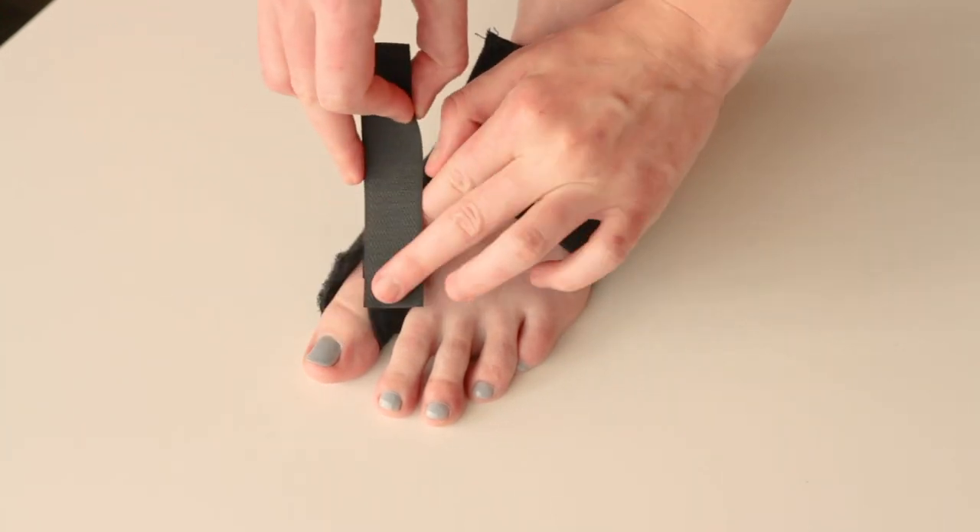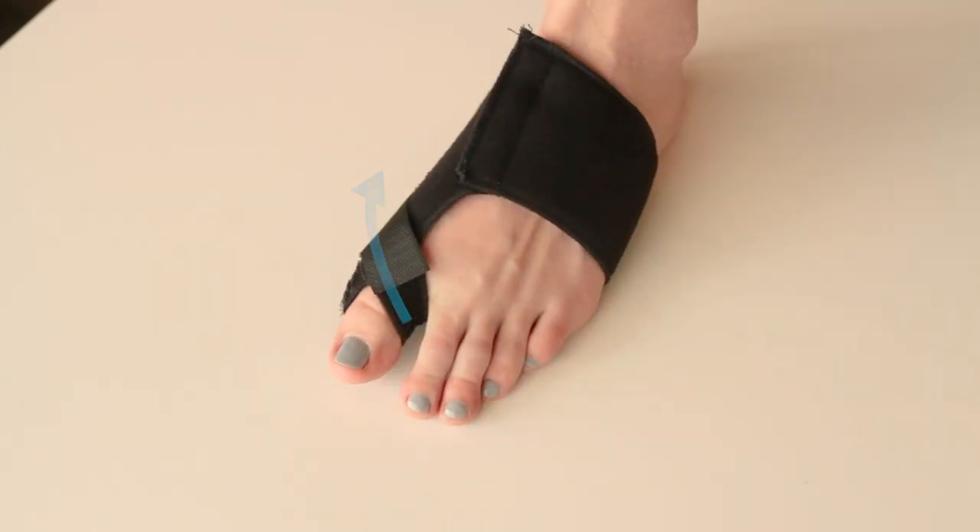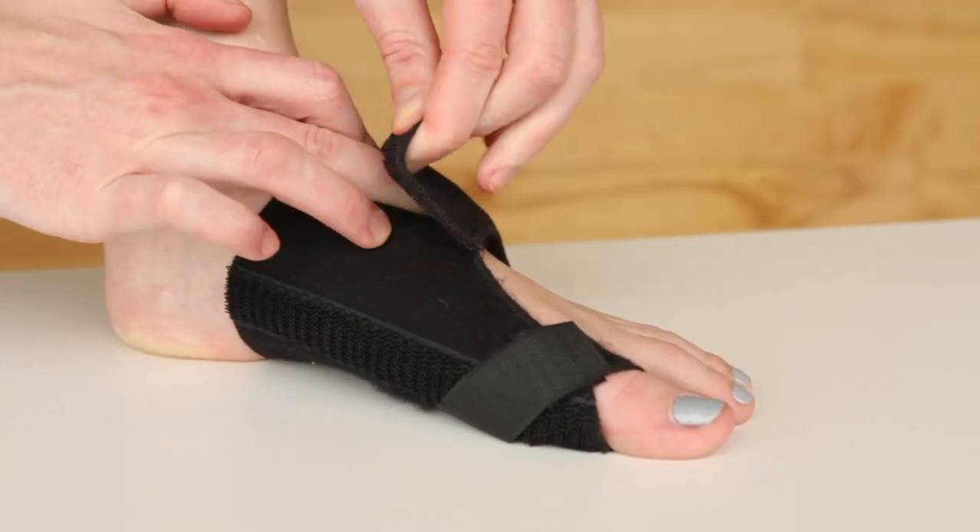Wrap it around your toe diagonally and secure, pulling tighter for stronger alignment. Adjust as needed for the best fit.